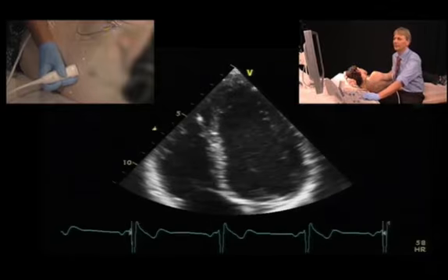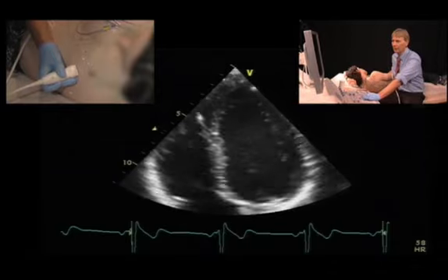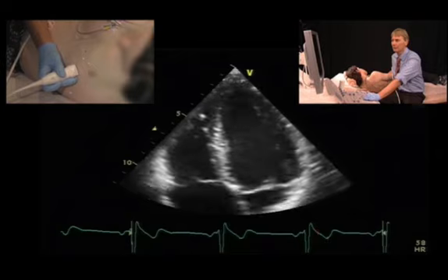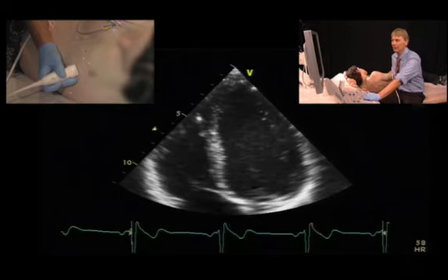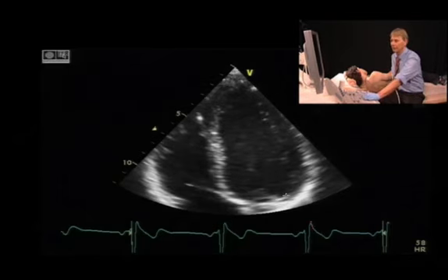We can freeze the image. Now sometimes we have difficulty to really determine where the endocardium is. It's usually easier if you move the trackball and the frames back and forth, because you can appreciate the contours better in a picture that is moving. And if you remember where the contour is, you will find it easier to track the contour then. So I will go to the measurement program and then I will trace the contour.